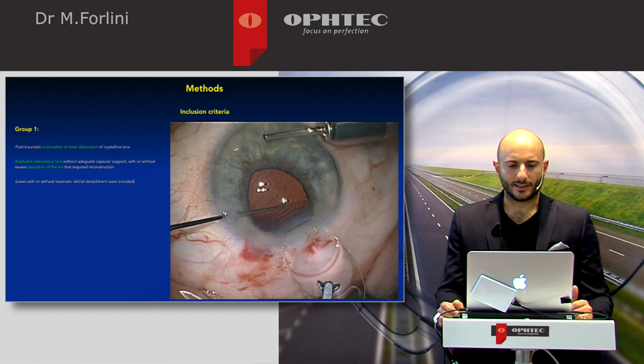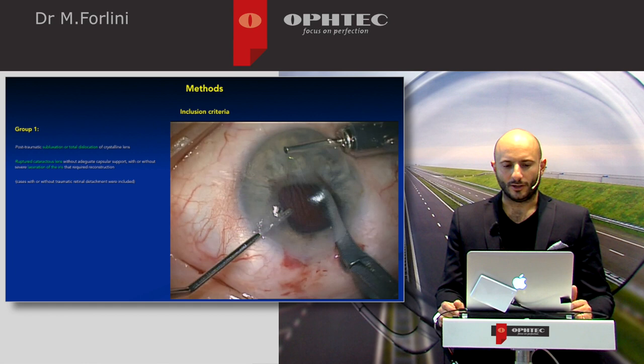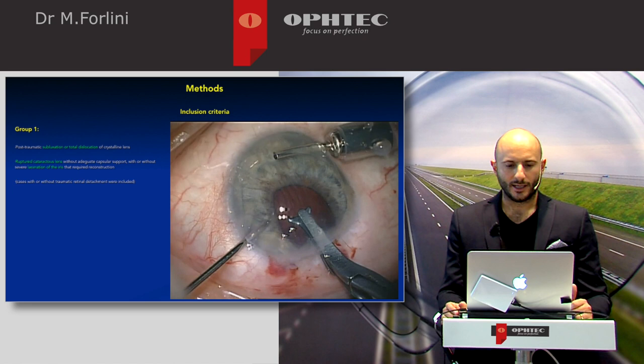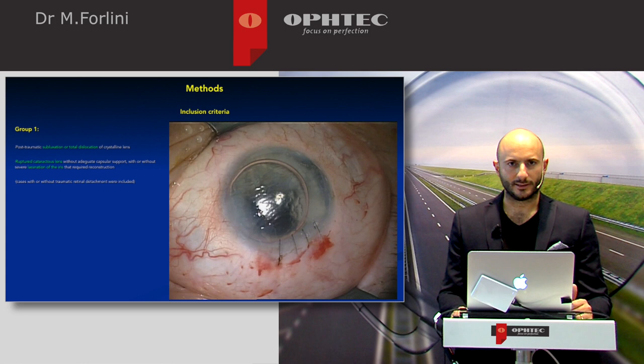You can see anterior chamber infusion and now the iris-claw implantation on the posterior surface of the iris — in this case, we preferred the retropupillary implantation. With the dominant hand, we are holding the lens and with the other hand we are doing the enclavation with the spatula. We are focusing on centration of the lens, the enclavation is done, the iris is centered, and the anterior chamber is good.